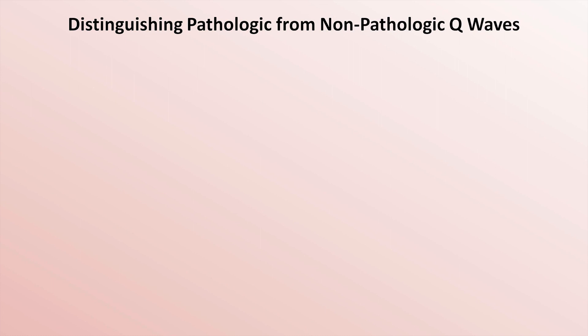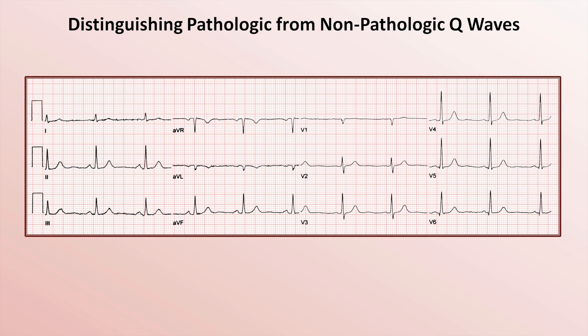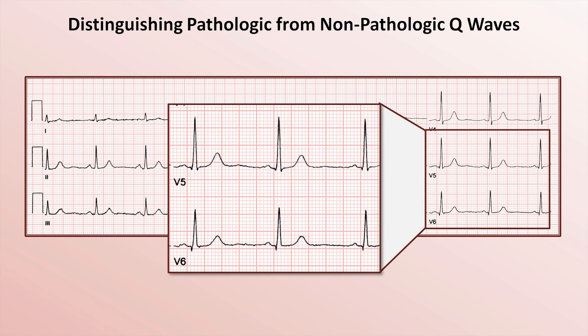Here's an example of a normal EKG. If we zoom in on leads V5 and V6, we can see the tiny downward deflections at the beginning of the QRS complexes. These are septal Q-waves.